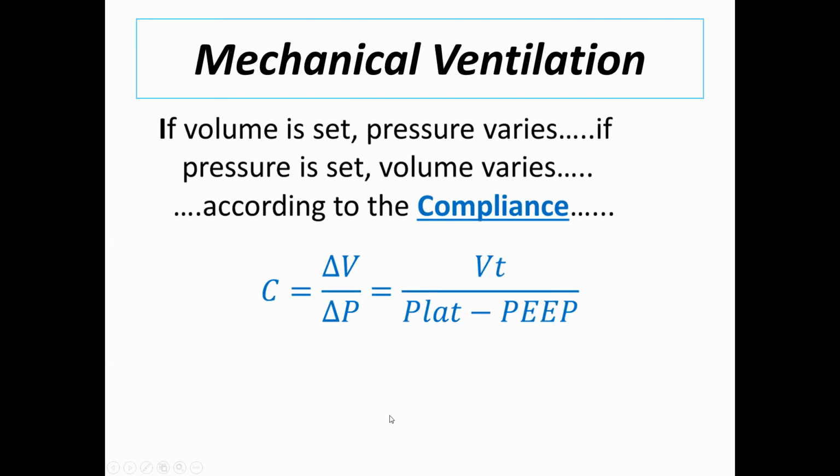So in adjusting the ventilator, you start dialing up by very small increments. Every time you dial it up, you sit there for about 5-10 breaths and you calculate your driving pressure. If the driving pressure is still decreasing, then you keep on doing it.